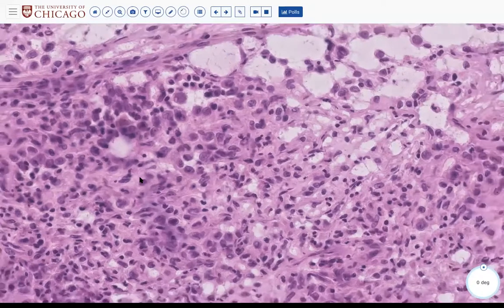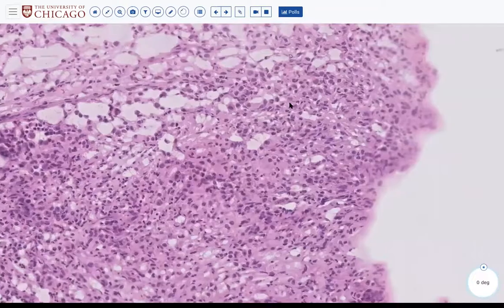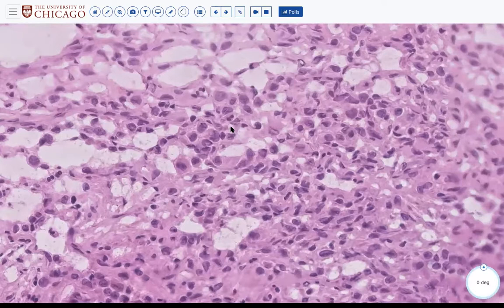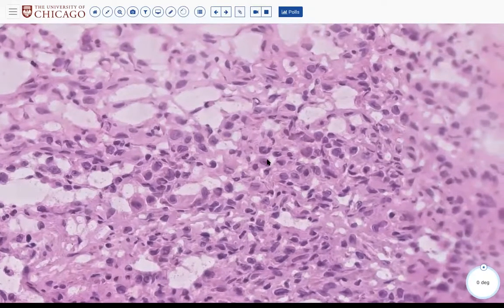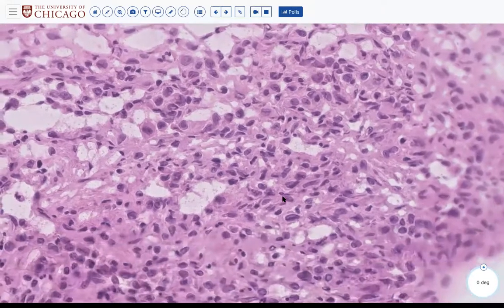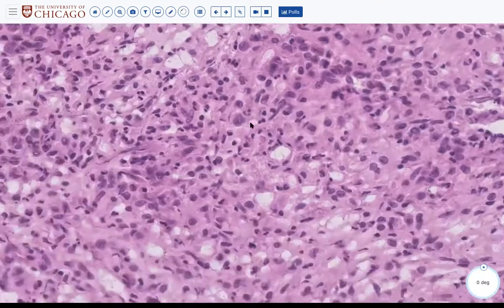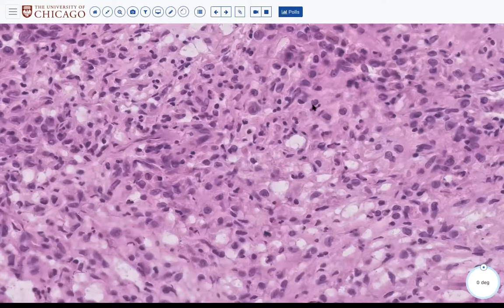Yeah, so clinically in this case, the differential was really between a Langerhans eosinophilic granuloma type of lesion and a round cell tumor, especially in a young kid. I would argue that I agree with those who saw these grooves, these wrinkles, these almost fetal kidney bean shapes. There's actually a couple perfect ones right there. They're plump, sort of plump and juicy. Oh, there's a nice one. Kidney bean shaped nucleus.